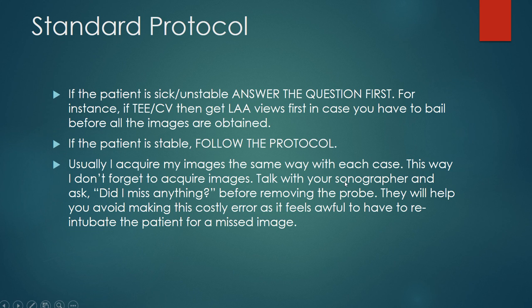Now this protocol works because it prevents us from having to constantly go up and down in terms of our degrees, and so we'll obtain a bunch of views, and then we'll already be at a certain degrees and acquire views at that degree. Also talk with your sonographer. Ask them before you pull the probe out, did I miss anything? It's awfully embarrassing to have to re-intubate the patient because you missed a critical portion of the exam.